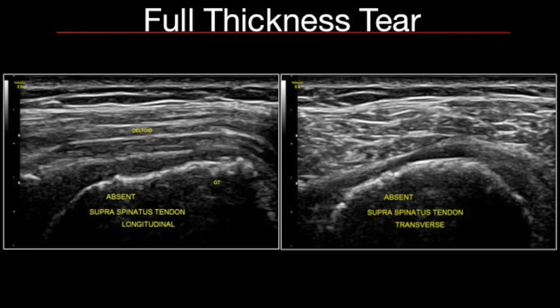When counting layers from the top, if you see subcutaneous fat and deltoid directly resting on the cortex, the supraspinatus tendon has completely torn and retracted medially — this is called the bald head sign. A massive tear is described as complete detachment of two or more tendons, most commonly the supraspinatus and infraspinatus, resulting in superior migration of the humeral head.